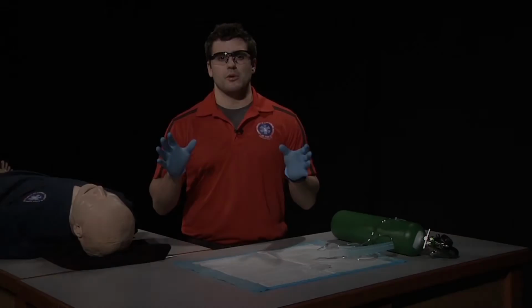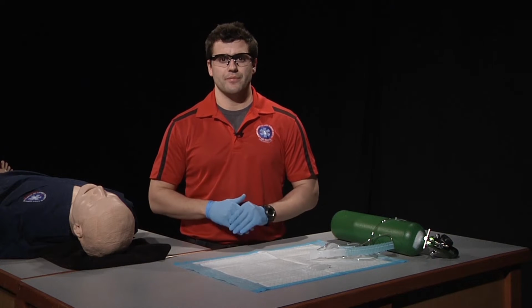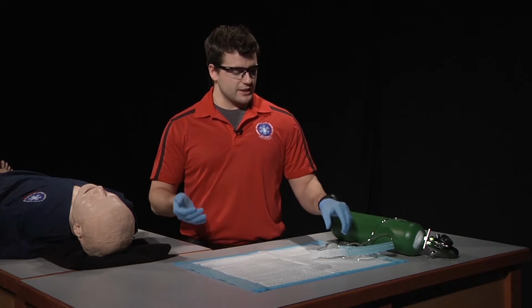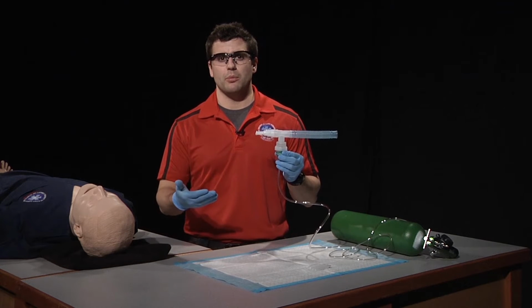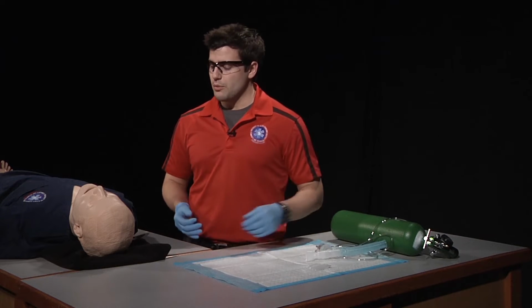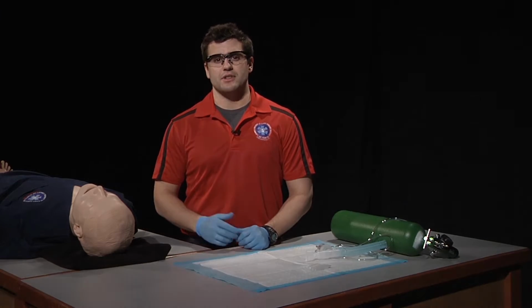Now it's time to put on the appropriate PPE. For this skill, it's eye protection and gloves. From there, we're going to remove the oxygen mask from our patient and instruct them to firmly hold the nebulizing unit up to their mouth. From there, we will coach them through breathing appropriately until all of the medication is gone. After that, we'll put the oxygen mask back on them and observe them for desired and adverse effects.